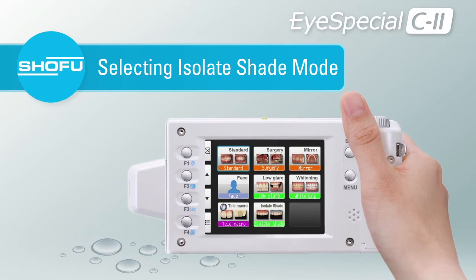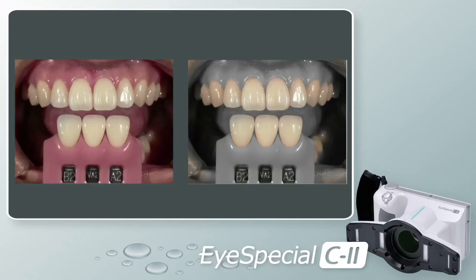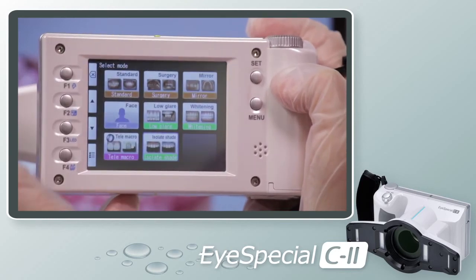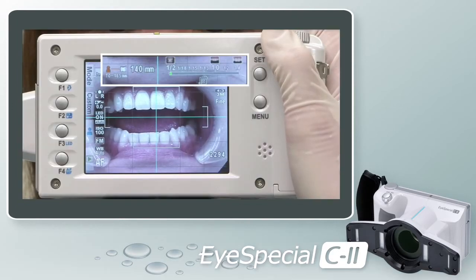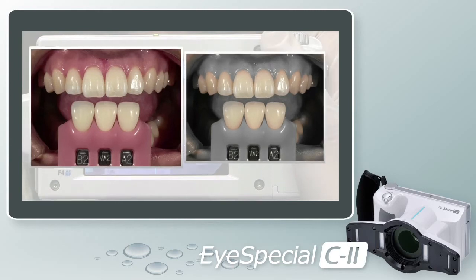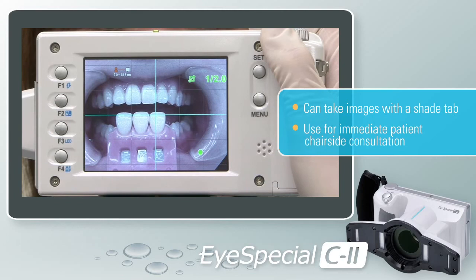Selecting Isolate Shade Mode. Isolate Shade Mode is a fantastic tool for shade taking in the dental office as well as at the bench in the laboratory. It is also an ideal communication tool between the dental office and their labs. Press the F1 key or touch the Mode button, then select Isolate Shade Mode. Select your magnification range and take the shot, following the cues to distance and range. In this mode, two images will automatically be saved — an image where the gingival shade has been grayed out, and the original color image. You can even use it for immediate patient chair-side consultation.